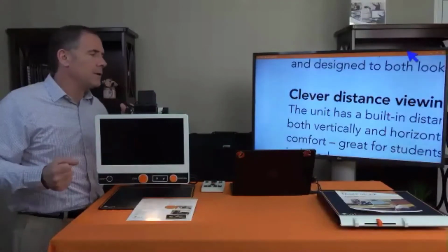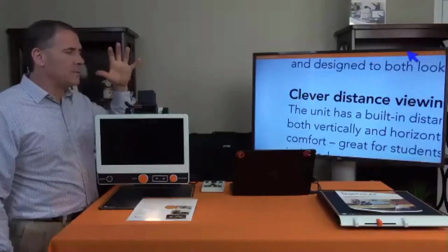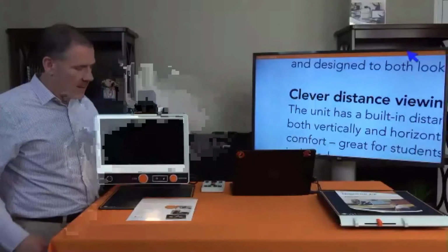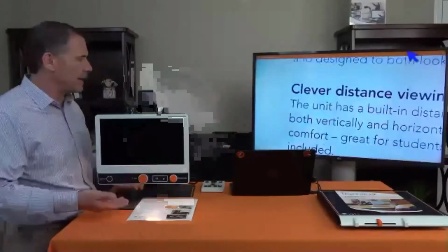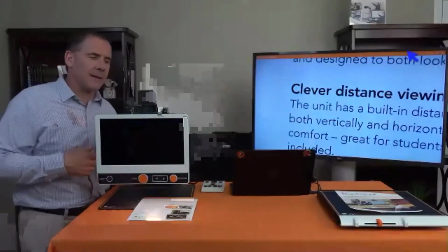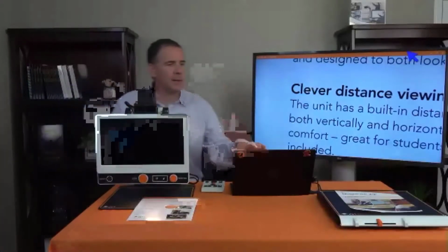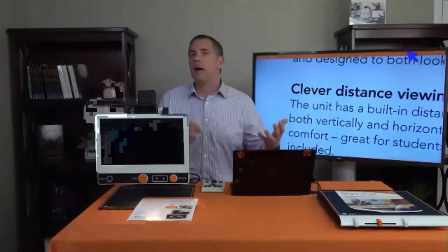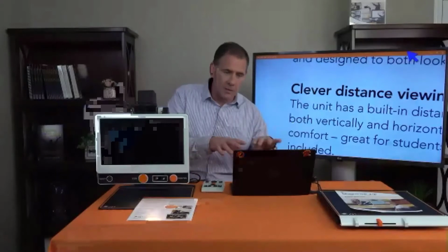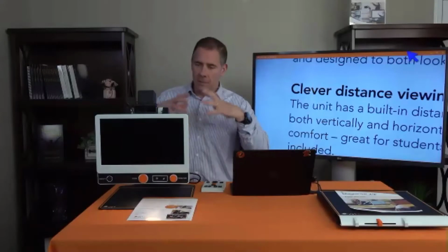This turns into, if you come next week, an MLS. It allows me to take pictures in the distance, to record video and audio in the distance. It allows me to place anything under it, OCR it, TTS, which I'll do shortly. It basically allows me to take all that this camera sees and pass it into the computer, and then I could save. I could take a picture of this document, drop it into Word, answer questions on a test, and then email it back to my teacher. It really opens up a lot more functionality.